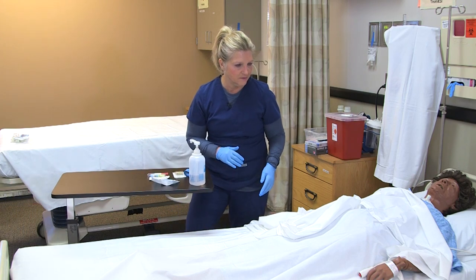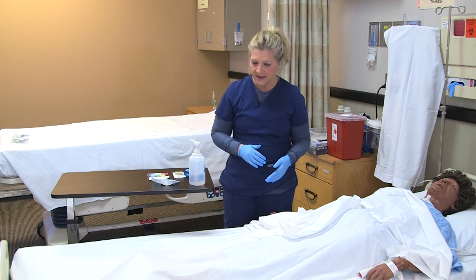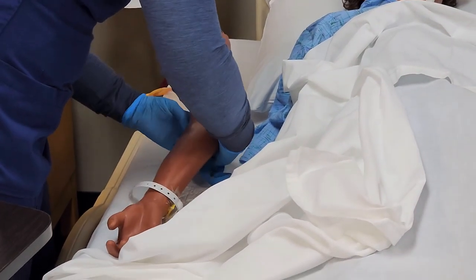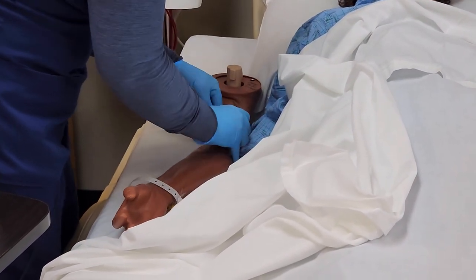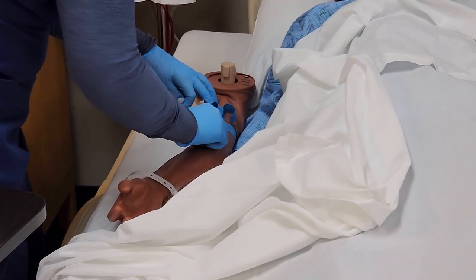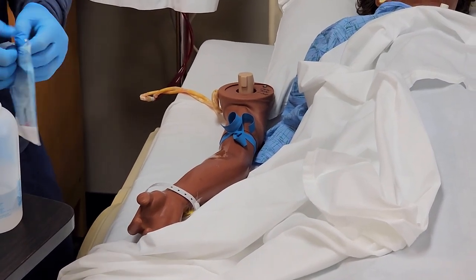The patient has no history of lymphedema in that arm, no IVs running, and no history of stroke — in which case you'd want to use the other extremity. I'm going to grab my tourniquet and place it about two inches above the draw site. Then I'll use an alcohol wipe to cleanse and disinfect the area, and let that dry.